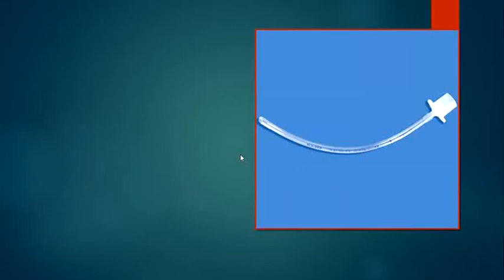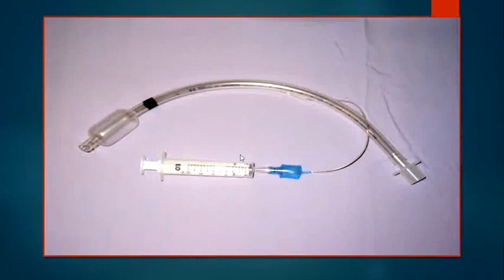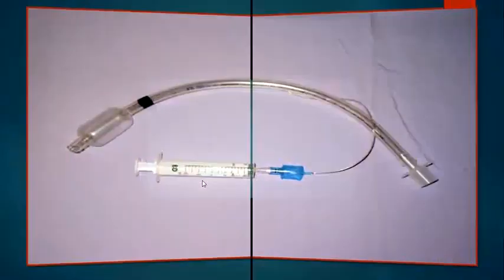This is, of course, the uncuffed endotracheal tube, and this is the cuffed one. Of course, the cuff should be inflated, like what happens with the Foley's catheter, for example, when we give 5 or 10 ml of distilled water to inflate the Foley's catheter to make a fixation point inside the bladder.